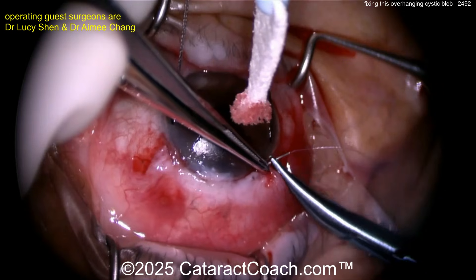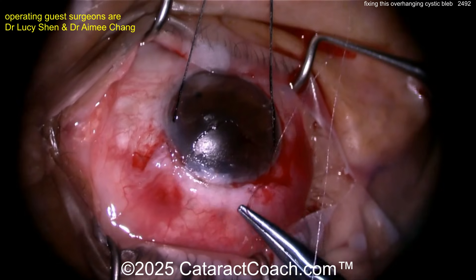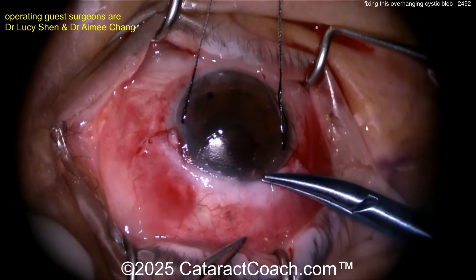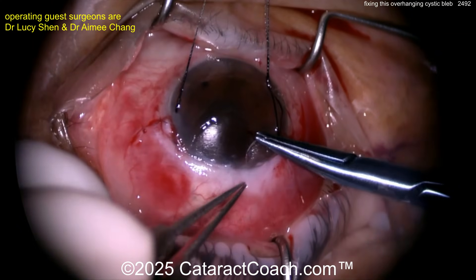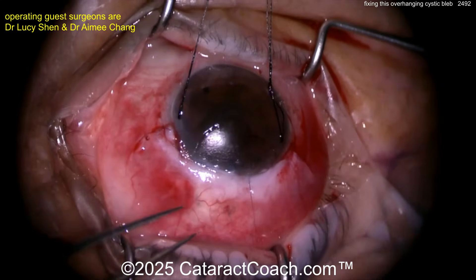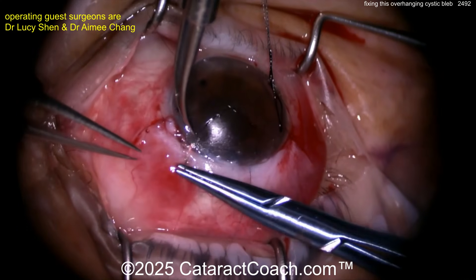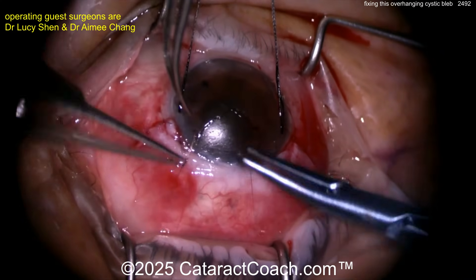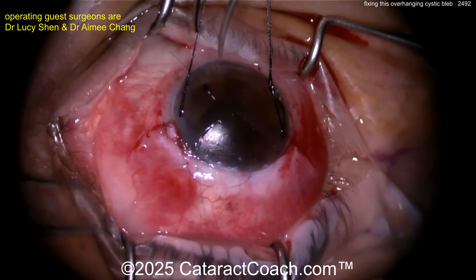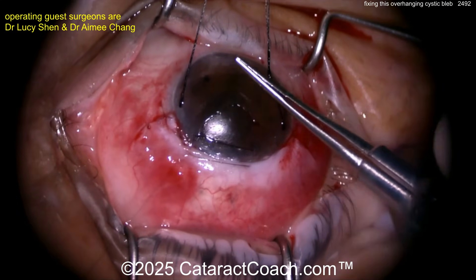Close the conjunctiva with 9-0 vicryl sutures in each corner, then a horizontal mattress suture of 10-0 nylon. Dr. Shen sent this video after seeing a previous glaucoma video on CataractCoach showing a different approach to fixing a thin cystic bleb, and offered this alternative technique. The horizontal mattress suture goes in forehand then backhand, tacking down the conjunctiva right at the limbus.